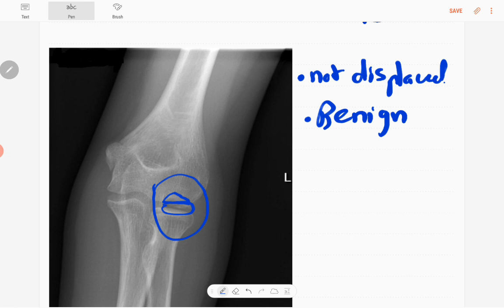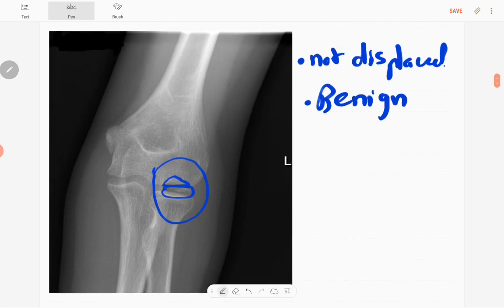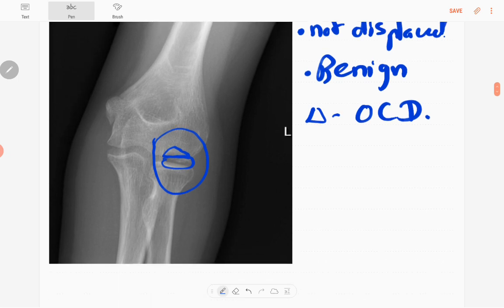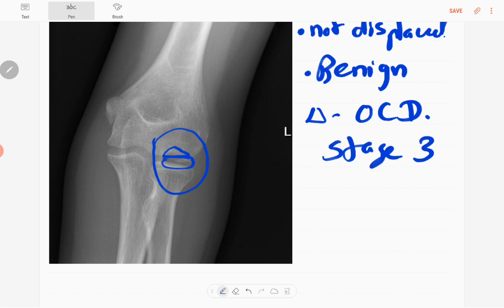There is no dislocation of the joint and the rest of the bones appear normal; soft tissues also appear normal. The diagnosis of this lesion is osteochondritis dissecans. The stage of the OCD is stage three because this fragment is detached but not displaced. There are no osteoarthritis features.